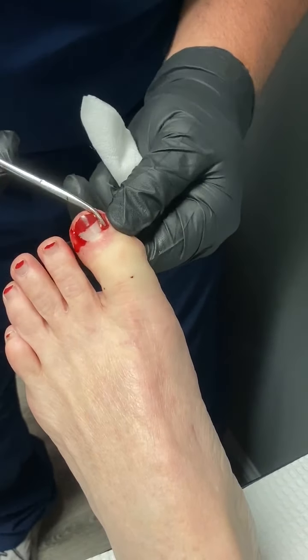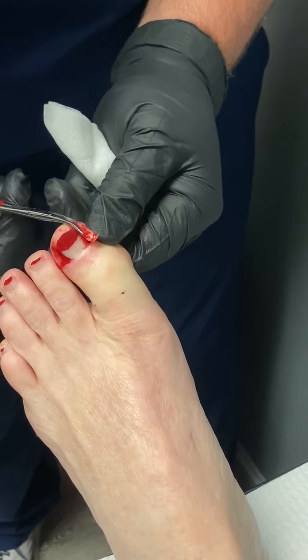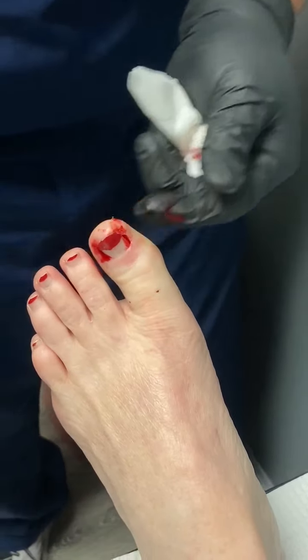Gosh, it doesn't want to go. There we go — that was a monster. There it goes, we gave birth! So that's an ingrown toenail.